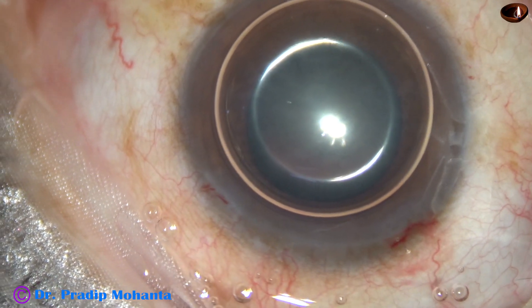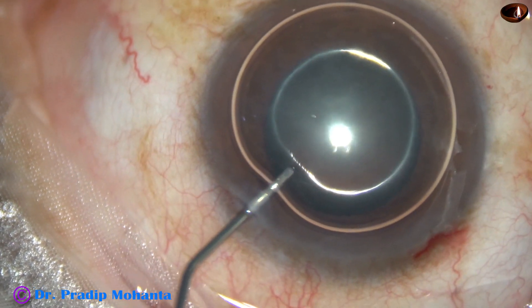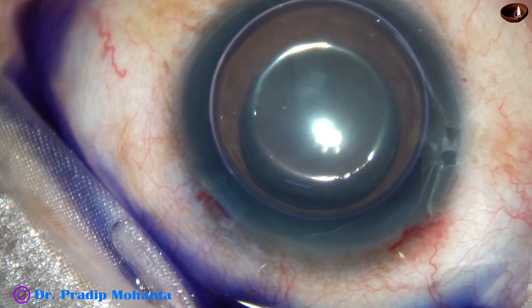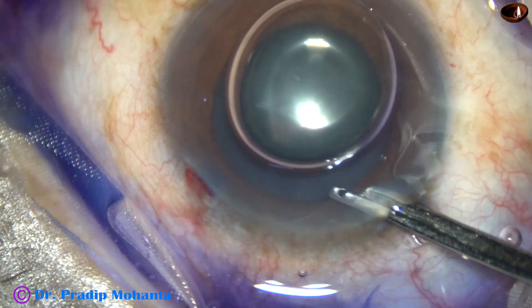An air bubble is injected into the anterior chamber and then trypan blue 0.06% dye is applied over the anterior capsule. The dye is washed out.